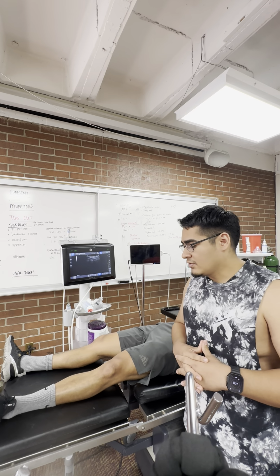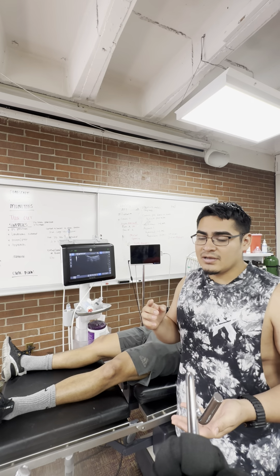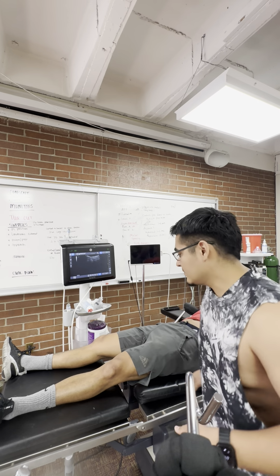So we'd also have the patient connected to all our monitors, making sure we have SpO2, end-tidal CO2, blood pressure cuff, and EKG. We'd also want to make sure that we've done an airway assessment just in the event that we were to need to intubate the patient. This patient is Mallampati 1, no signs of any difficult airways. So we have the appropriate supplies, we have them on the monitor, and so we would be able to proceed. Consent's been signed, so we should be good.